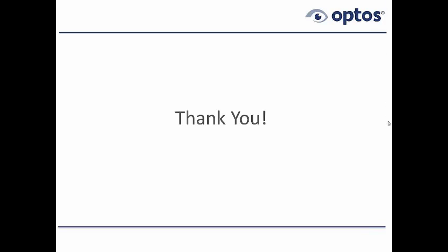So, Jerry, you touched upon the fact that there's different ways to image with fundus autofluorescence, one being blue laser, one being green laser. Can you tell us a little bit about the differences between those and which one is better than the other, in your opinion?